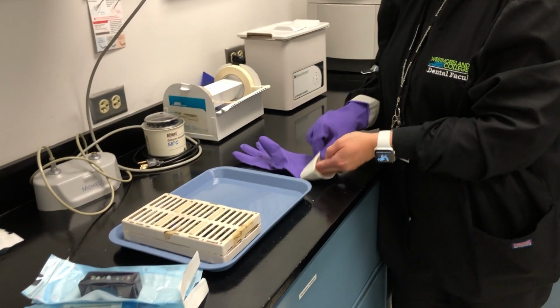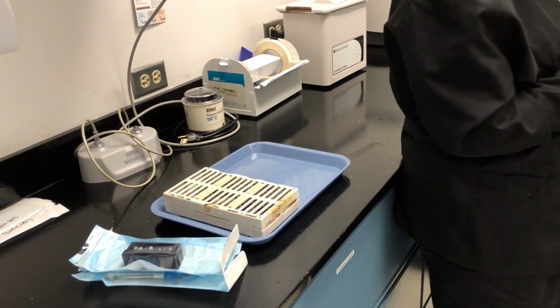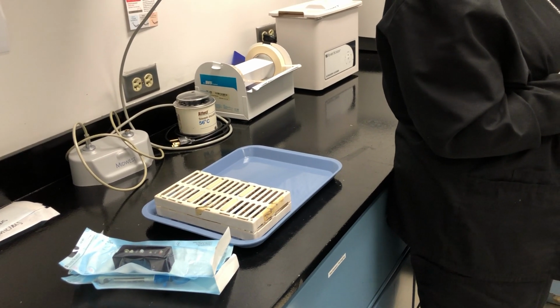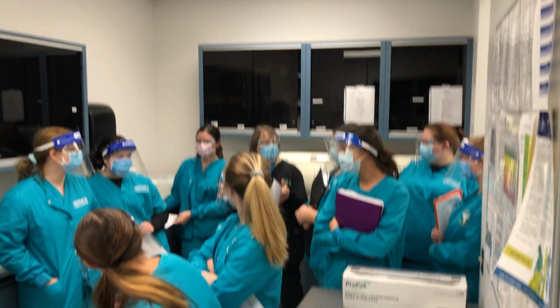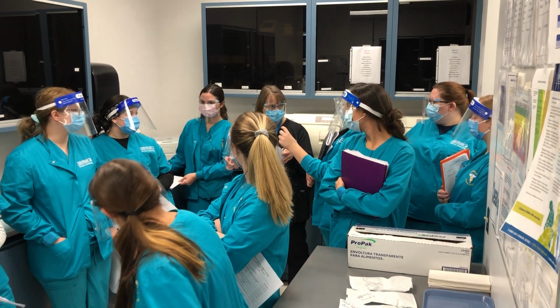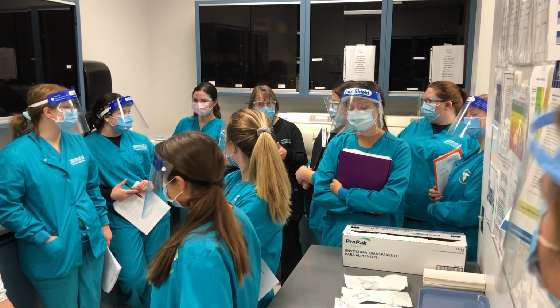Do you remember, was there a burr block in that cassette already? Remember the large cassettes that had all the different arrangements of amalgam? Was there anything else extra in there besides instruments? There was, I think, the dental dam piece. There's a burr block in there. There was an amalgam well in there.